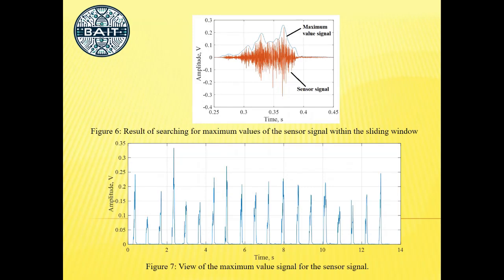Furthermore, it is necessary to process the received signals to highlight in their structure information about the peculiarities of impact on the elastomeric insert. Further, those signals will be used to form actuator control signals. Processing methods should ensure signal processing in real time with minimal delays.